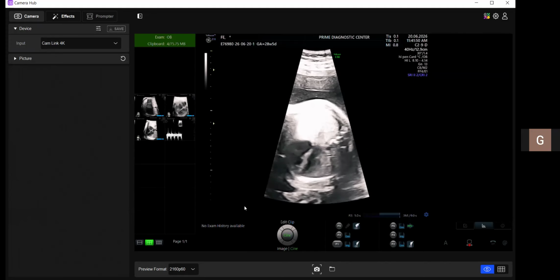Sir, sphericity index, will it help? Sphericity index is okay. Visually I see it, and I think you're right, maybe it's looking more spherical for the RV, but you have obvious RA-RV dilatation. We talk about sphericity index when you don't have something obviously present. If LV or RV are dilated, they can make the heart spherical. Sphericity is for subtle findings when everything else is looking normal. So I don't apply sphericity index if I find some abnormality.